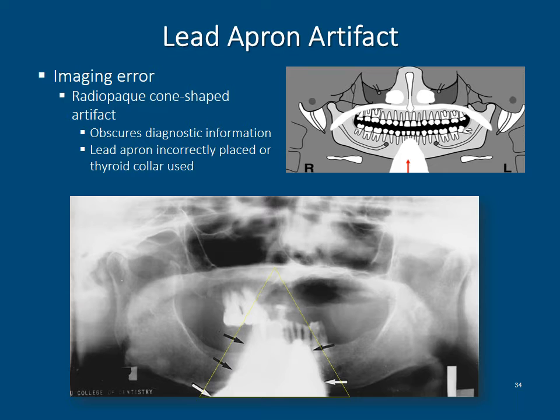If the apron is improperly positioned so far up close to the neckline on the patient's back, it may also block the beam of radiation, resulting in this clear area or white unexposed area on the film. So this image is not just isolated to using the wrong type of lead apron, but also its position across the patient when you're using a non-collared lead apron.